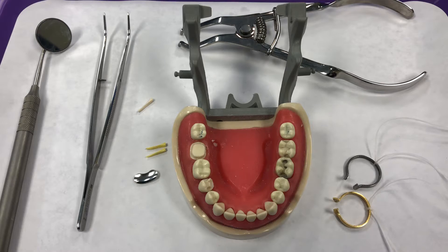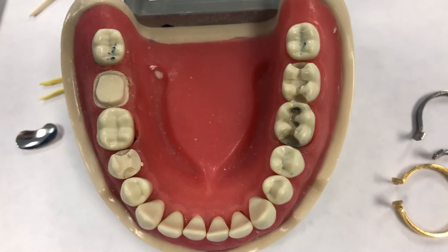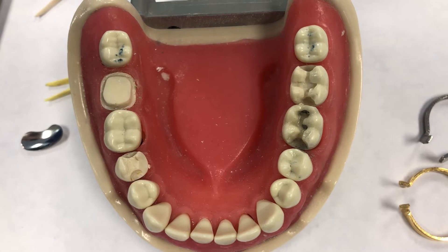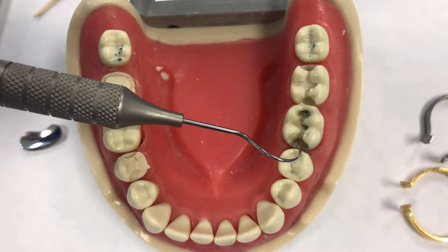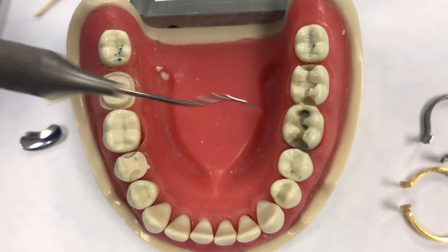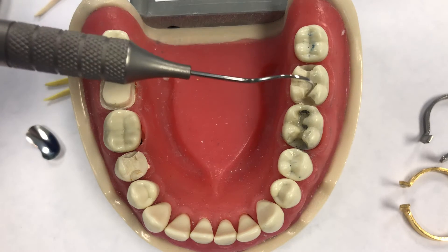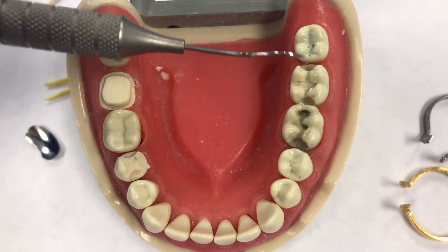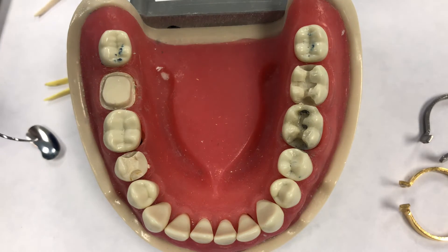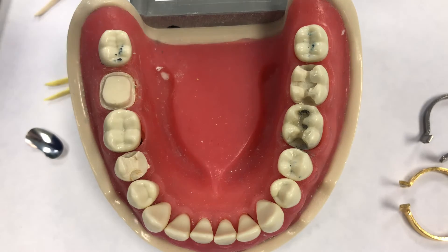I'm going to bring the camera a little closer so you can see the preparation better. We're dealing with an MO prep, that's why we only need one matrix piece. If we were going to work on tooth number 18 — if you notice it's an MOD — I would need two matrices: one for the mesial side and one for the distal side.